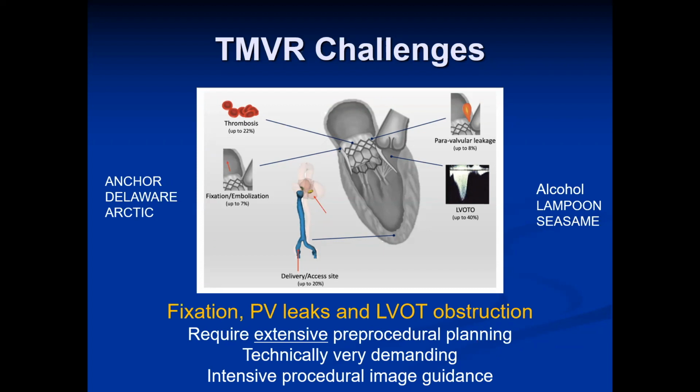Then you can still preserve physiology with chordal preservation of a bioprosthetic valve. So I agree with you. That's a binary decision. If you go to a clip, that could potentially decrease the opportunity to repair the patient. However, on the other side of it, we're starting to work harder on seeing whether or not we can remove the clip and still repair the valve.